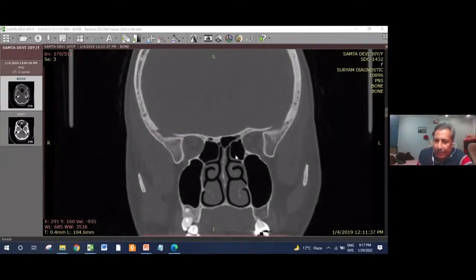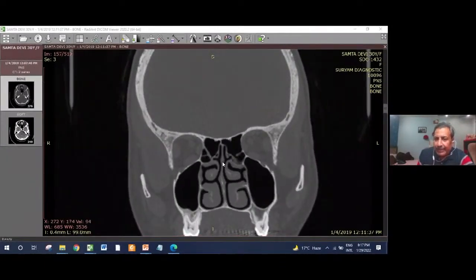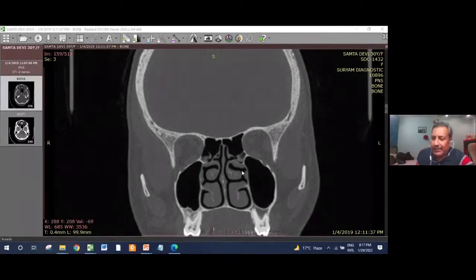So now, as we go behind, the things are changing. See now, your septum is there. This is your postethmoid. This is a postethmoidal roof. So you can carry out this posterior ethmoidal sinus surgery now with these box boundaries in your view. Above is the skull base, medially the superior turbinate. As long as you stay lateral to the superior turbinate, you are in the right cavity, and the postethmoidal part of the orbit is there in the lateral relation.